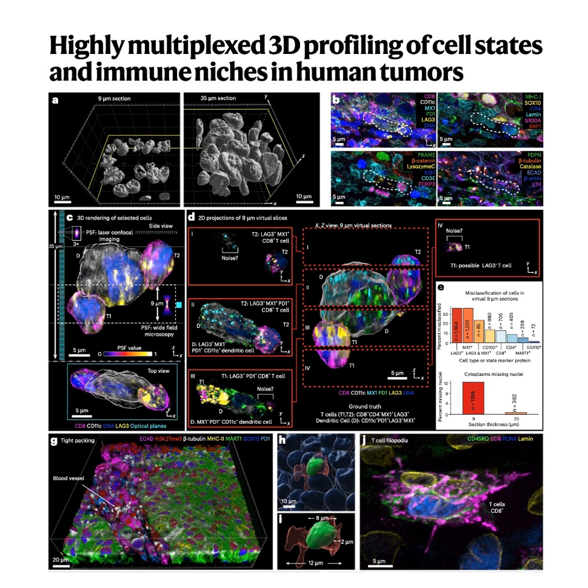So the 3D view reveals not just if a protein is there, but how it's organized, which tells you about the cell's immediate function, presence versus readiness. Precisely. It adds a crucial layer of functional context.